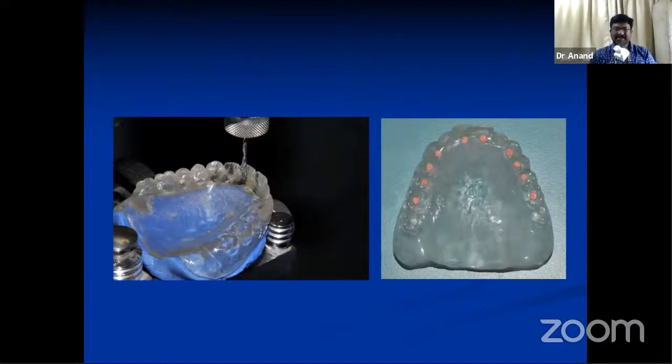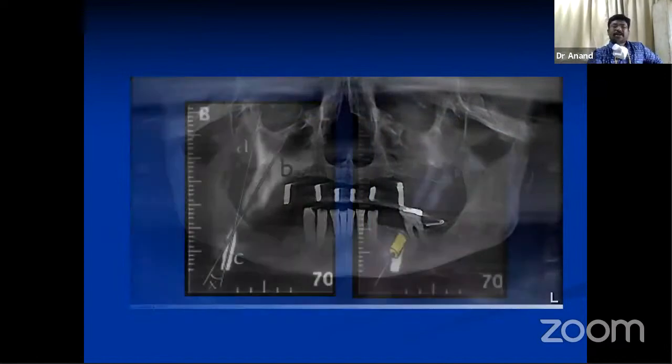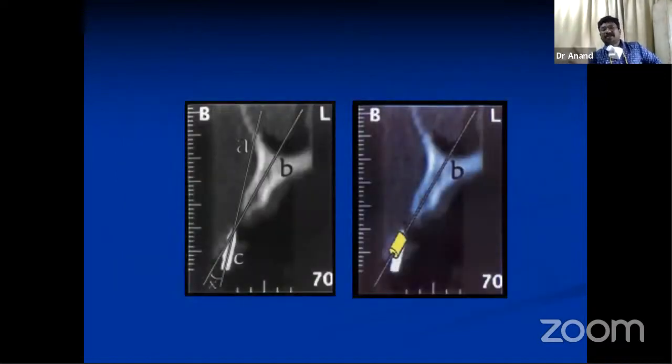For that, you make a similar denture and then place markers in relation to the proposed prosthetic screw axis. Here I have made the markers in relation to the cingulum and also in the posterior region of the back tooth. The gutta percha has been placed till the base of the denture, and then a scan can be obtained like this. Once the scan is obtained, we will be able to know the position of the marker and the position of the bone. So depending on the position of the bone, the angulated abutment can be easily calculated, even with normal CBCT software, if you apply all these techniques.